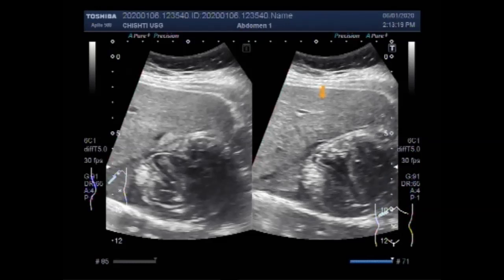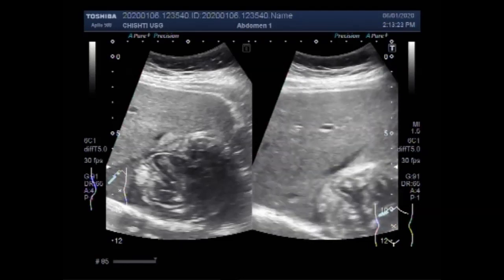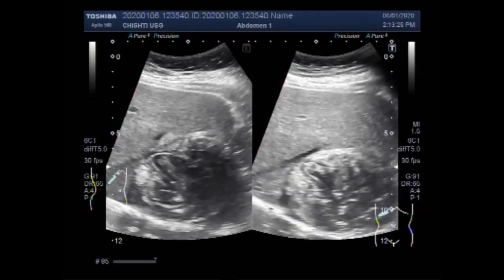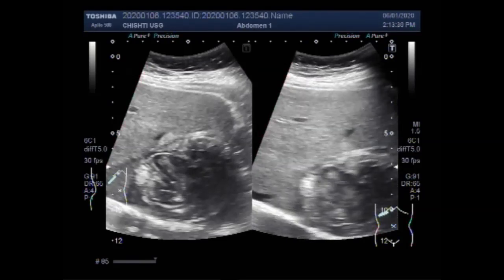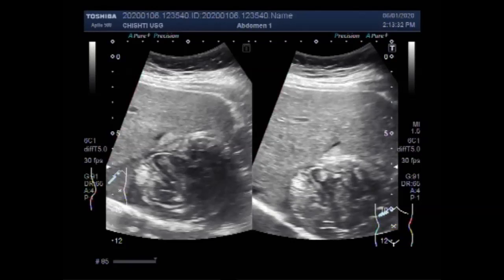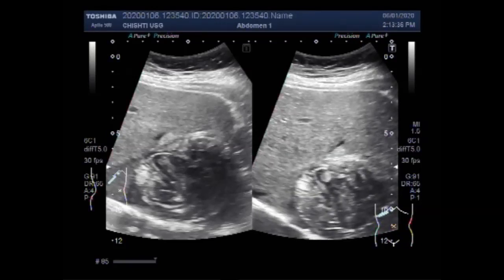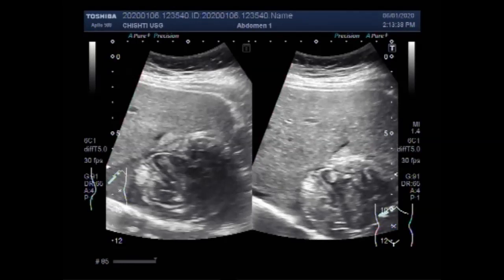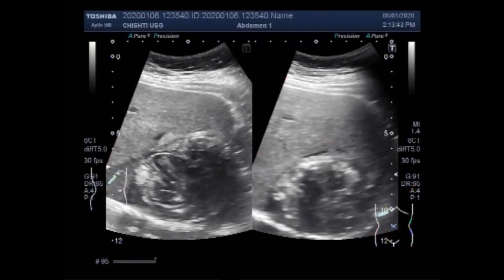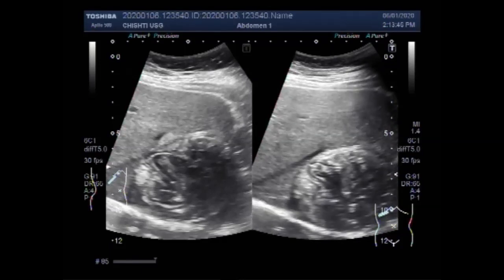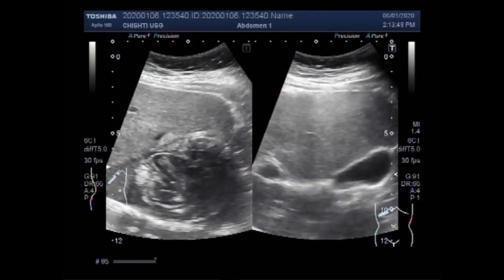Again, we change the position of the patient, and you will see in this view that this hepatic hydatid cyst lies in the lower pole of the right lobe of the liver. You can see there is considerable calcification and the disease is inactive.